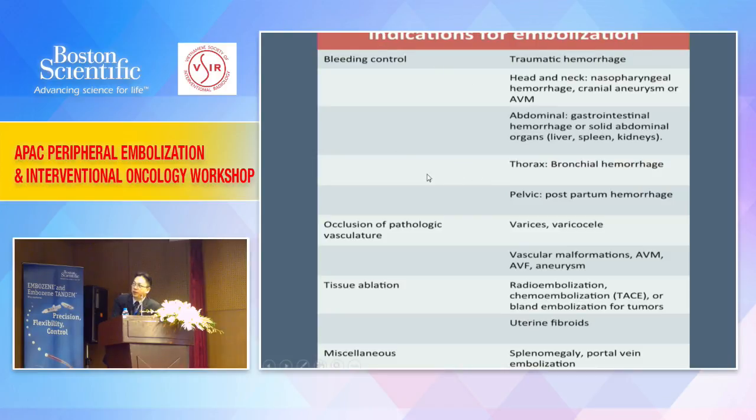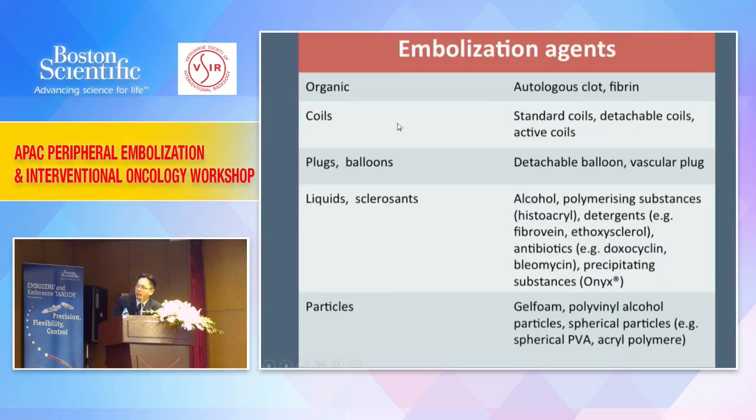And the indications of embolization are many. I think in the interest of time, we bypass these slides. If you want to embark in the field of embolization as an IR, you have to know every single product, indication, property, contraindication, and usage very well.